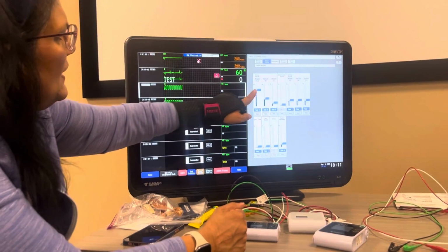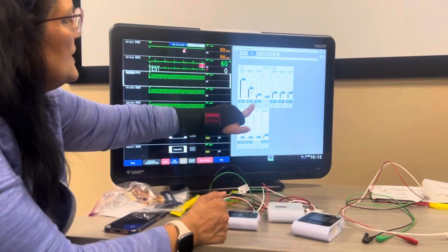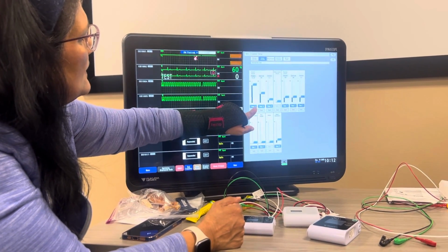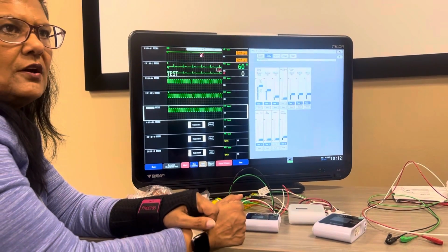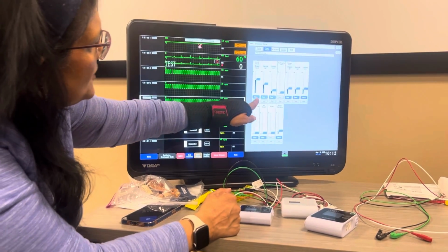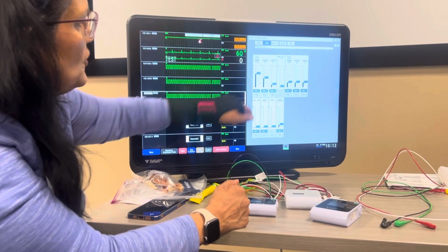This on, so you can actually increase the tone. Just touch this and then an arrow pops up. It's not going to let me test it, but you can increase or decrease it. You'll never be able to turn it off for safety reasons, okay? Don't touch the tone sounds, just the volume of the tone.